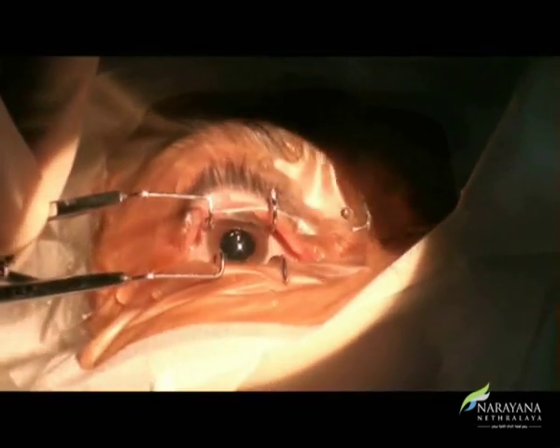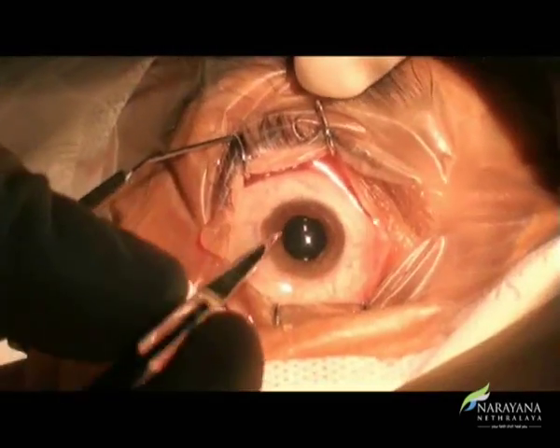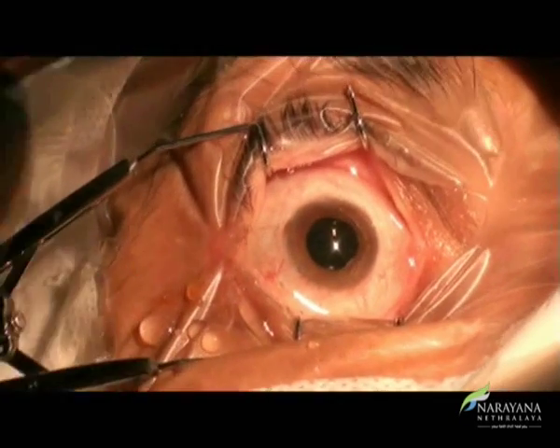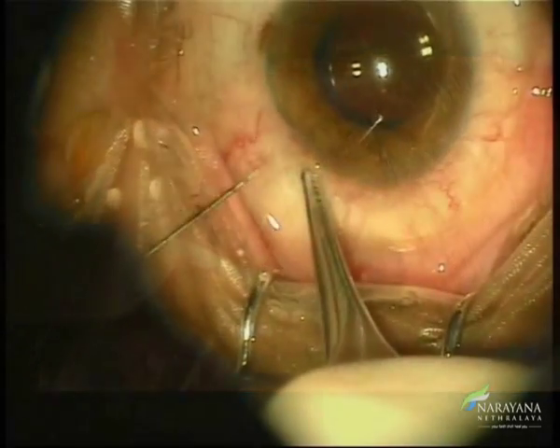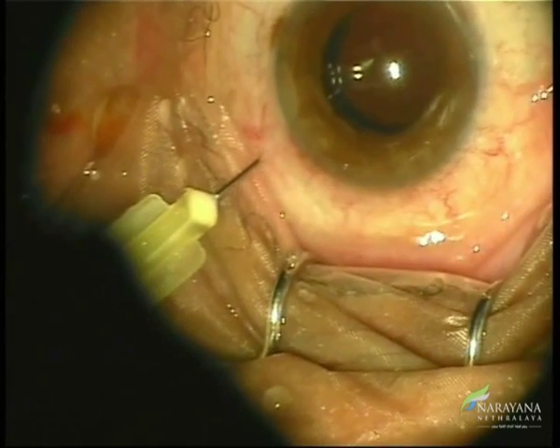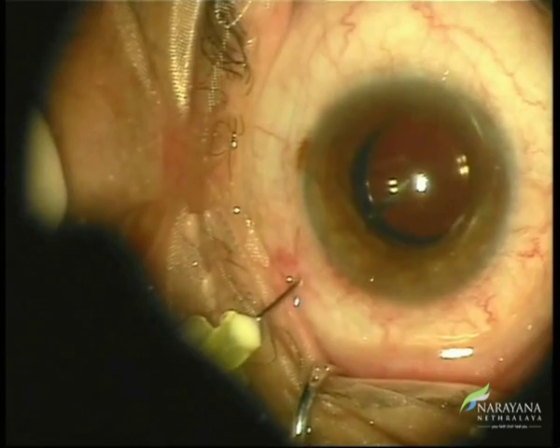The pupil should be dilated enough to visualize the tip of the needle through the microscope while injecting. The site of injection is measured with the caliper from the limbus, and a cotton-tip applicator is kept at the side to minimize pain. The needle is inserted perpendicular to the surface of the globe, stabilizing it with forceps, and directed towards the center of the vitreous cavity. Once the tip is seen, the drug is injected and the needle is withdrawn, keeping the site pressed with a cotton tip without massaging.